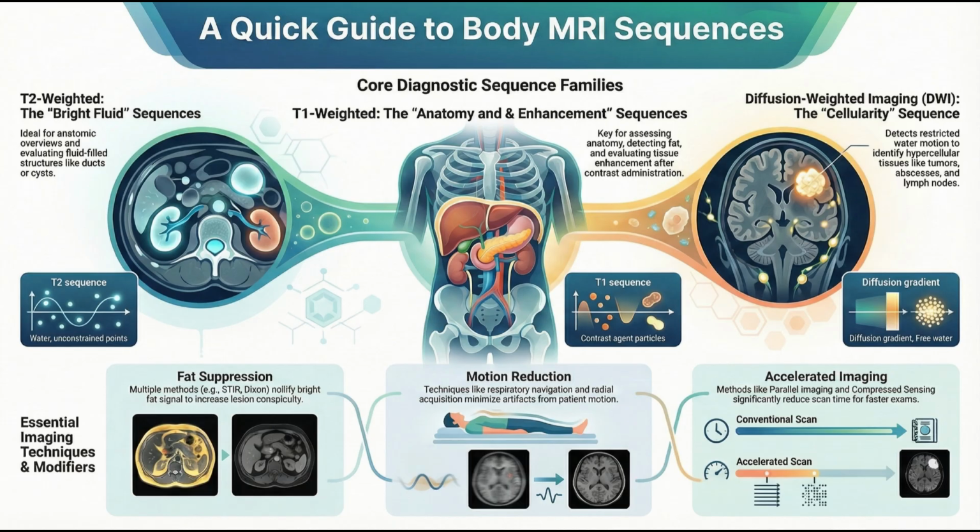It is. The number of tools in the MRI toolbox is growing exponentially, but if you don't have a solid framework for why you're choosing a sequence, it quickly becomes protocol chaos. And that is exactly why we're here today. This deep dive is really designed for you, the learner, to cut through all of that. We want you to understand the strategic framework behind it all, so you can look at any body MRI protocol, liver, kidney, whatever, and instantly know the purpose and how to maximize that diagnostic value.